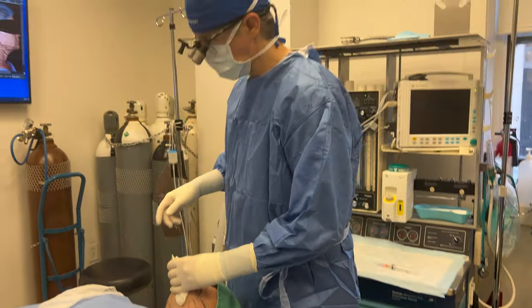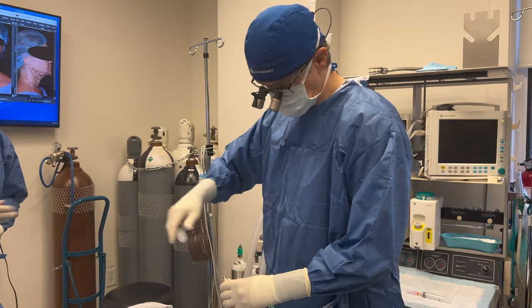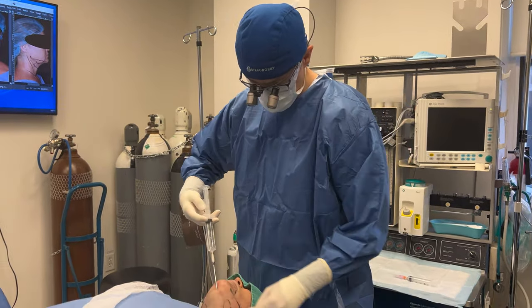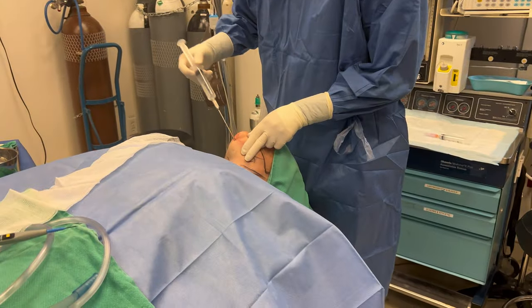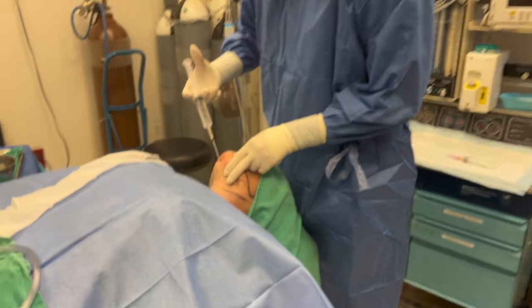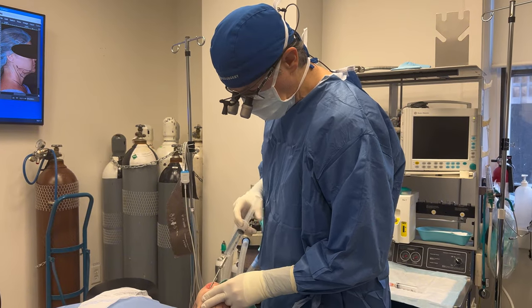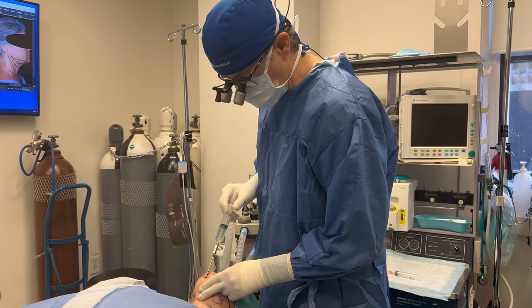Next up, there's some more freezing. The whole neck area is being injected with what's called a tumescent solution. It's got some local anesthetic and some epinephrine in it, which is going to help freeze the area and minimize bleeding and bruising after surgery.